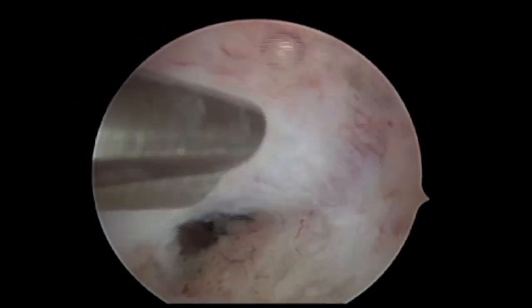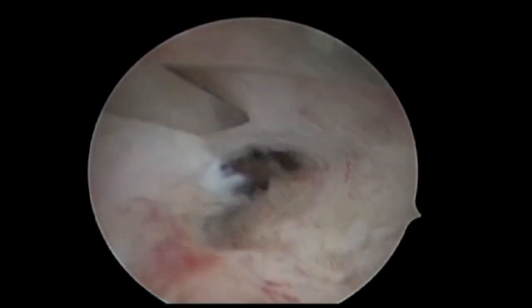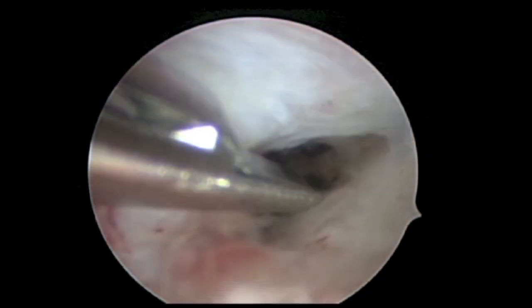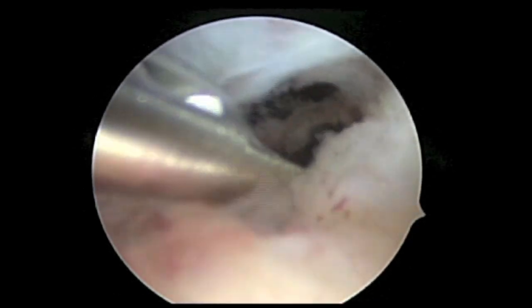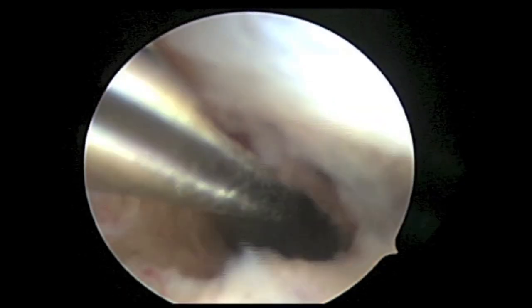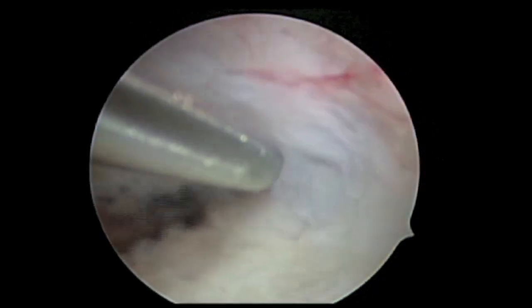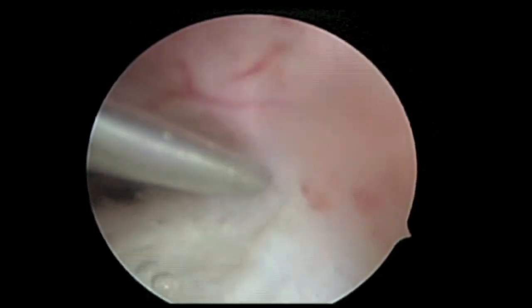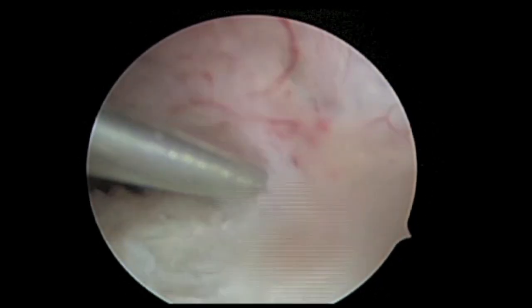At the completion of this case, we will see that once the mid-uterine adhesions are released, the fundal portion of the endometrial cavity appears normal. For further reassurance, the patient is brought back for a repeat diagnostic hysteroscopy, and we see maintenance of the normal shape of the uterine cavity.